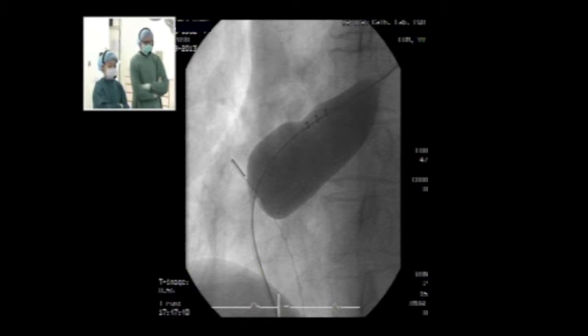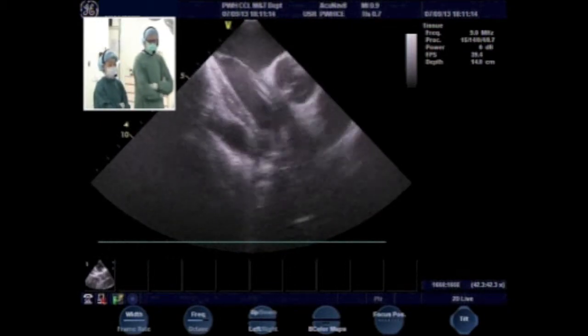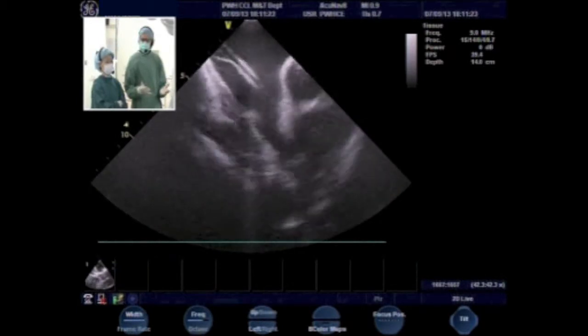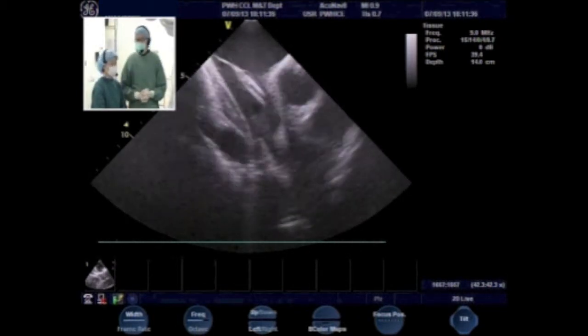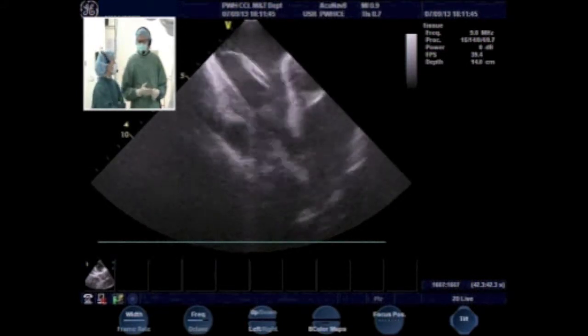Do you have an echo picture of the stop flow with the balloon? I think no, unfortunately we didn't store that. And what is the total septal length? We haven't measured, but it seems to be at least 4 centimeters. We can see echo again if we swap to echo. So I think there should be room enough for a large, but not extremely large, device. Again, it's about 20 millimeters unstretched, and 24, 25 with a balloon to a stop-flow position, with a little bit flimsy rim. So any suggestions for which device? We're going to close it using an Occlutech. They come in 21, 24, 27, 30.